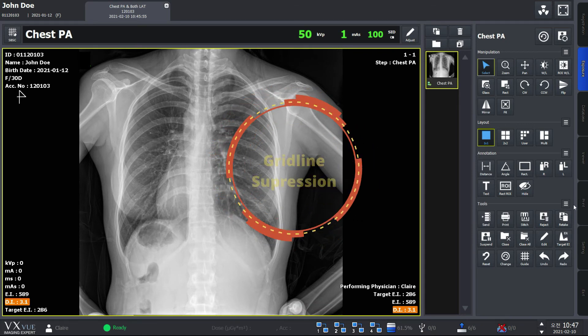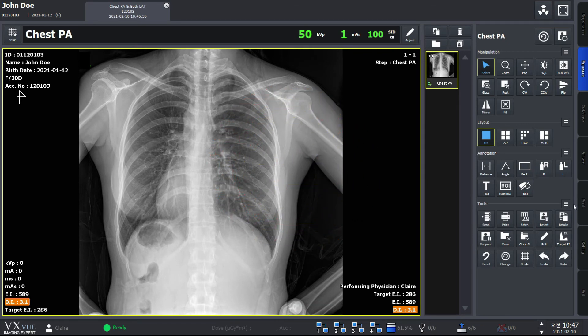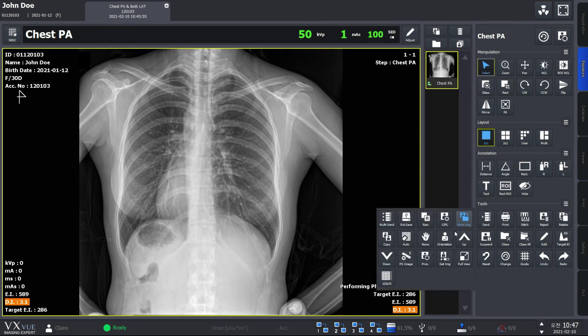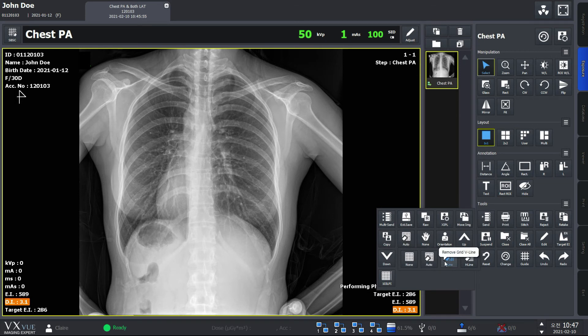VXvue supports grid line suppression function and you can preset options for grid line suppression, or grid suppression as indicated in VXvue, at the XIPL in the setting mode. This is the grid suppression icon. Here you can choose to remove the grid line automatically or choose to remove vertical or horizontal grids.